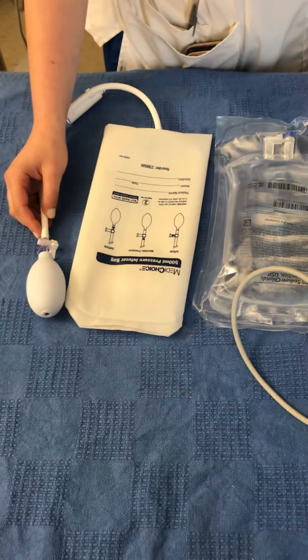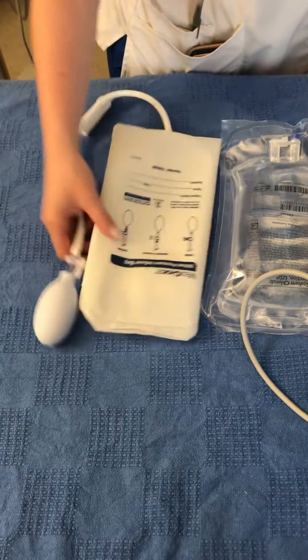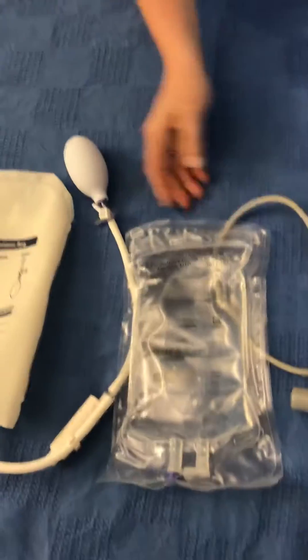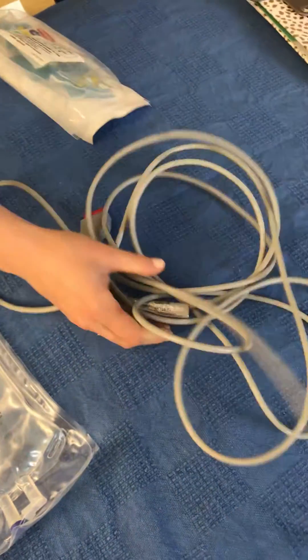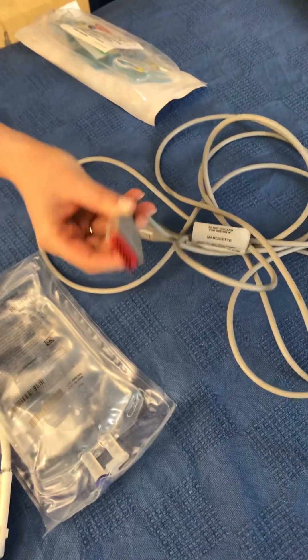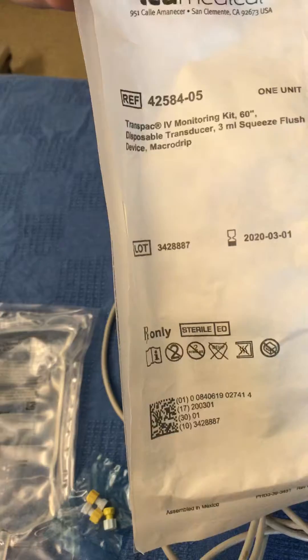We're here to discuss when you need to set up for an A-line or central venous pressure monitoring. The items you will need are a pressure bag, a 500cc bag of normal saline, the cable that hooks into the GE monitor for your A-line and central venous pressure — it's the one with the red part that plugs into the monitor — and the transducer kit, which includes the tubing.